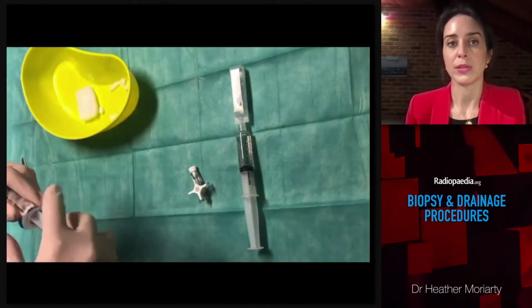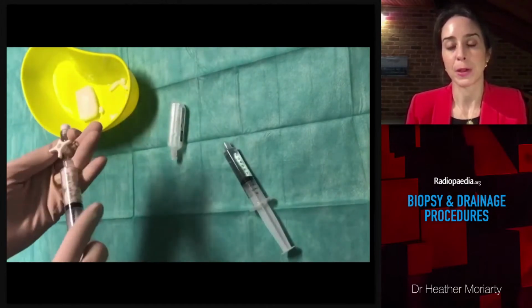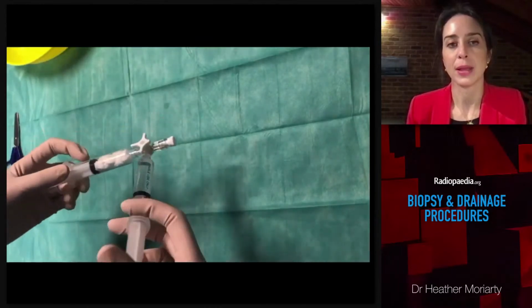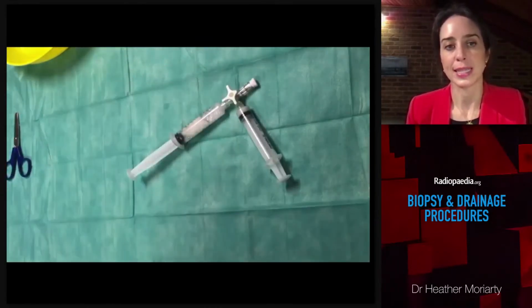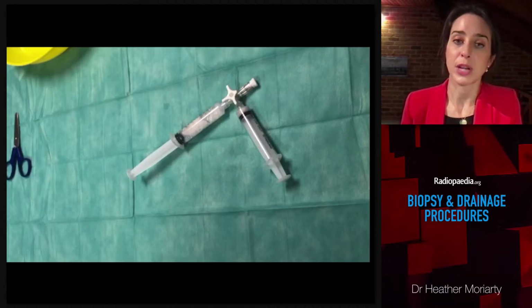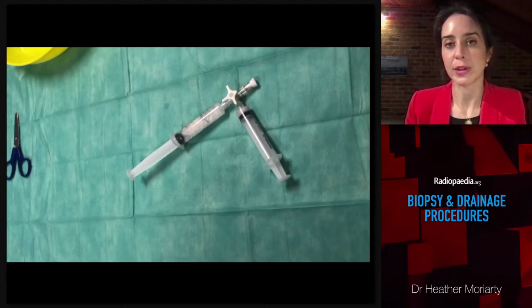This is a video of how to make gel foam slurry. You mix the gel foam or gelatin sponge with saline or with contrast using a three-way tap about 20 times, and then inject the slurry through the coaxial needle as you're withdrawing. Usually 2 to 3 mils is plenty. At the moment, I use this technique at my discretion on a case-by-case basis. For instance, if I'm biopsying a highly vascular lesion or viscera, or there is some element of coagulopathy.